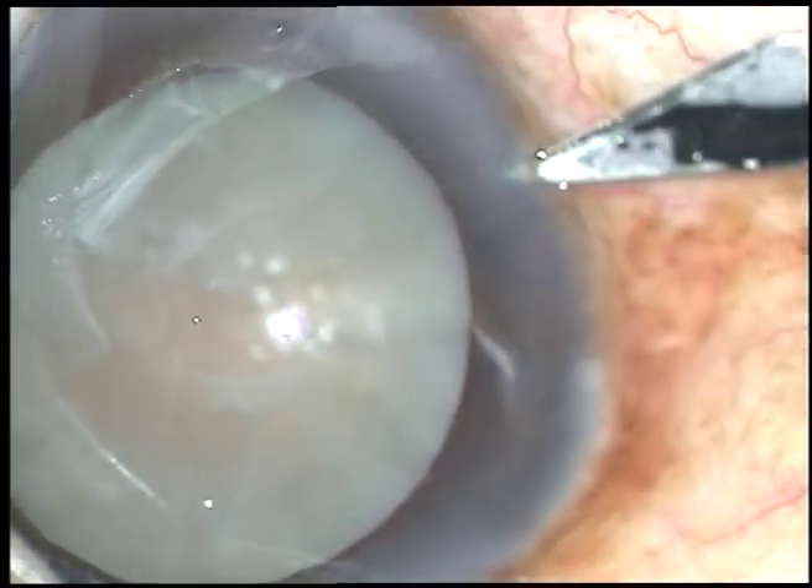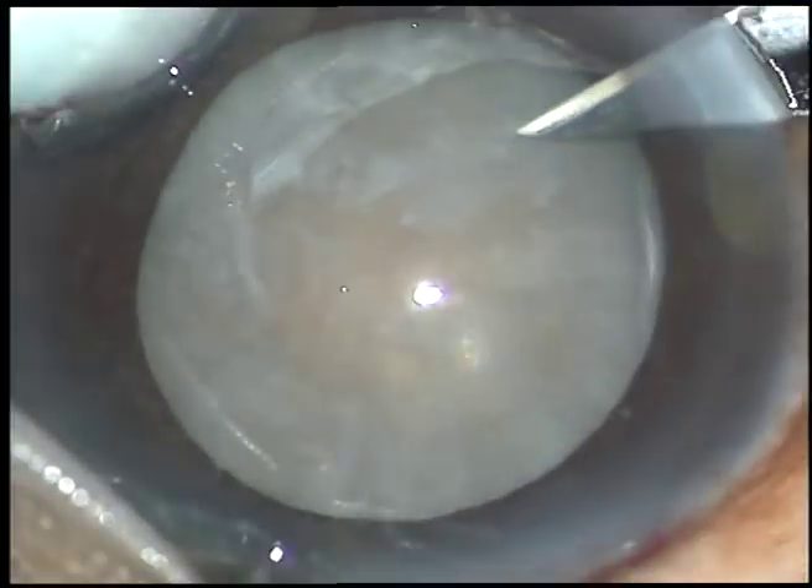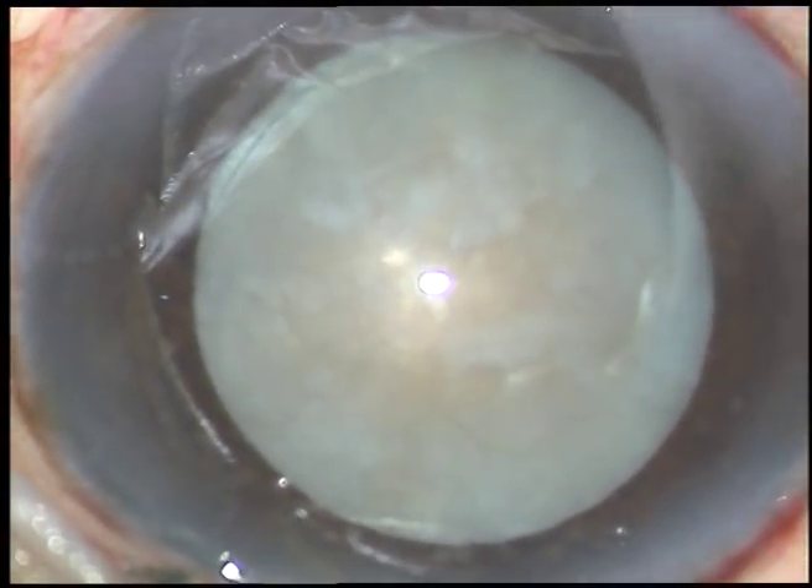The main incision has been made. Now, this is a side port on the right side of the main incision, about 3 o'clock hours away.